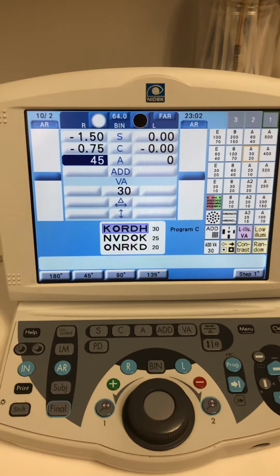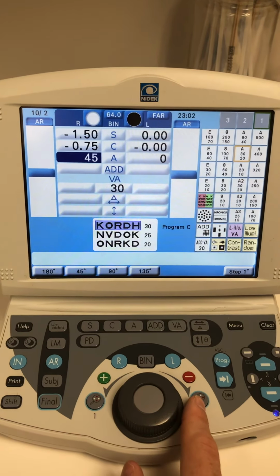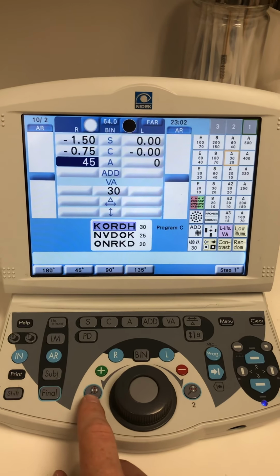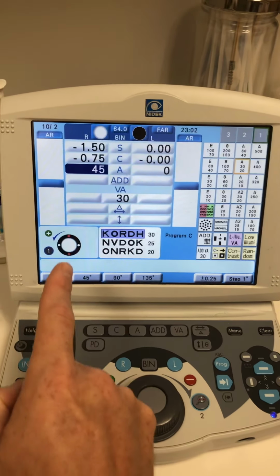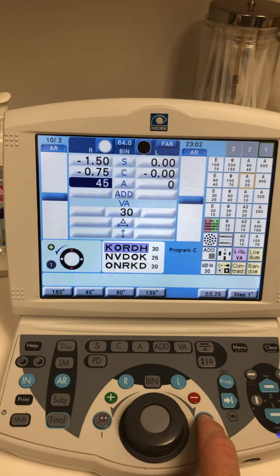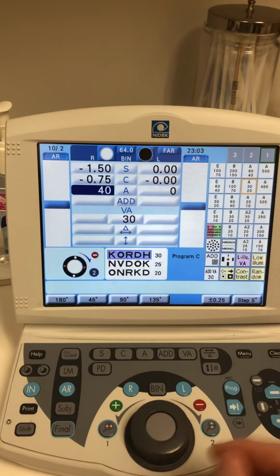Obviously you're going to do your axis next, and this is where you actually will use this regular chase the red feature on your JCC. The nice thing about the little module here is it just tells you which way to turn it. So you can go, which is clearer, number 1, and you can see the 1 with the rotation arrow there, or 2, 1, 2. Obviously, if the patient picks 2, boom. You can turn that as many degrees as you want. I usually start in 5 degrees.